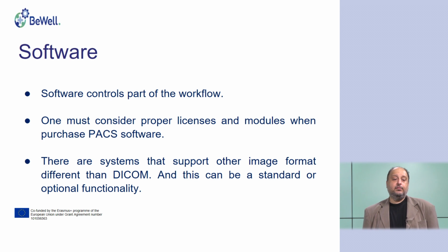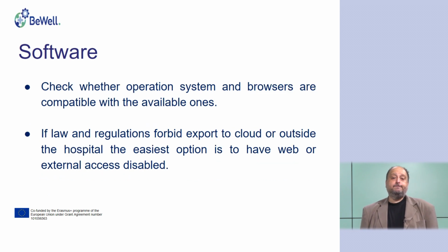And these systems, for example, may support other image formats different than DICOM, but if you need such, you have to look if it is included in the standard version, if it is an optional version, or if it is not available at all. The PACS software runs on a specific operating system, and you have to be sure that your operating system is compatible with the software, or otherwise you will finish with something that will not work for you.